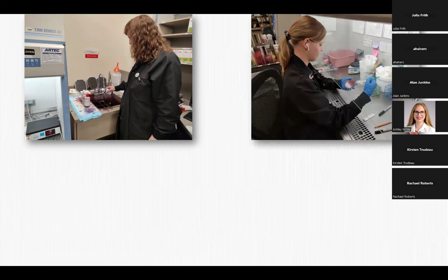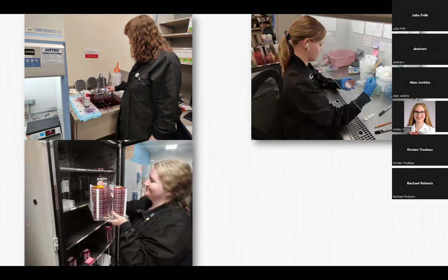This is Lily. She's streaking out plates like we always have. We can sit there, we streak out plates for hours. Once the plates have been streaked, they go in the incubator. Here's Morgan putting a batch of plates into an incubator.